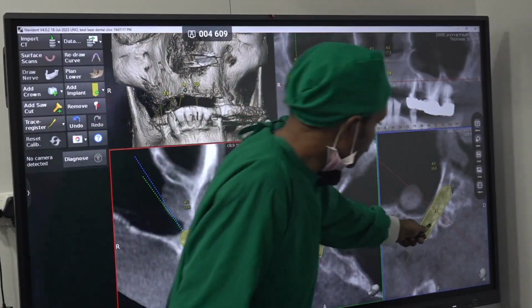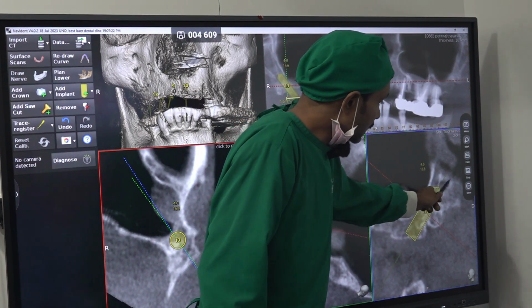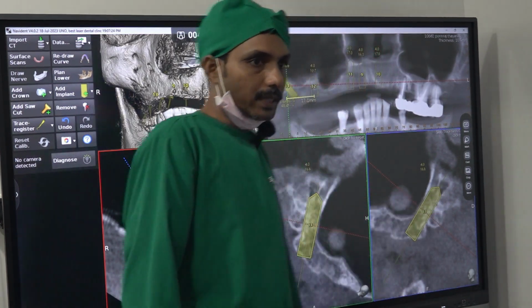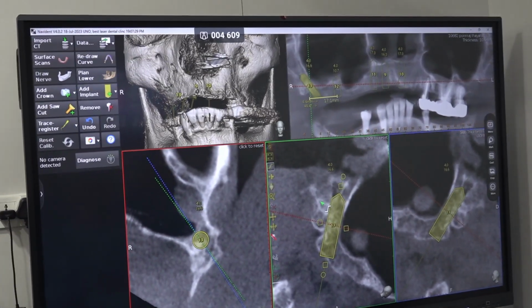Okay. So, this is the tuberosity, right? This is the tuberosity. It goes through the tuberosity. This is an entirely separate bone. It enters the pterygoid plate, pterygoid bone. We will try. If the pterygoid is not working out, we will.